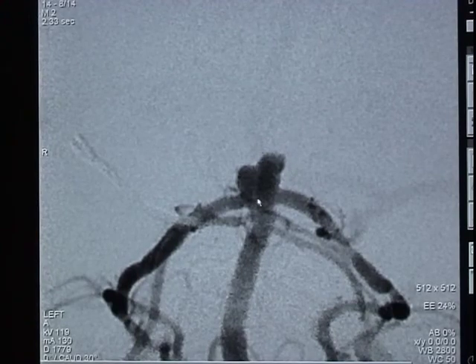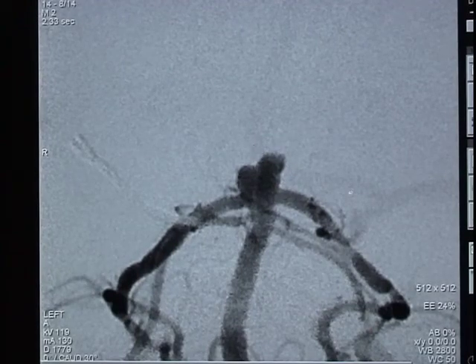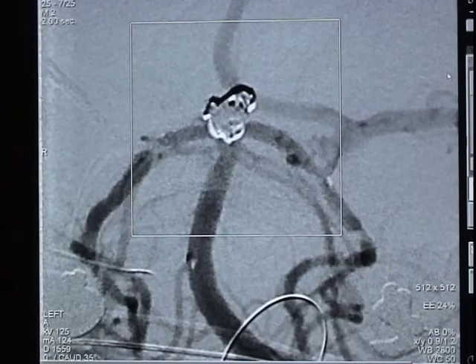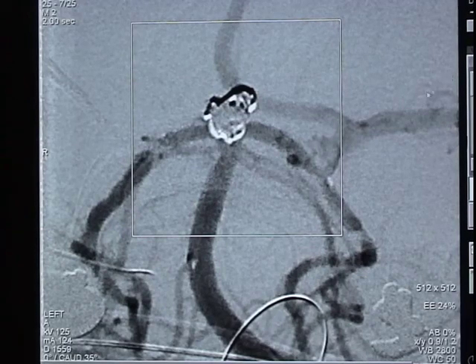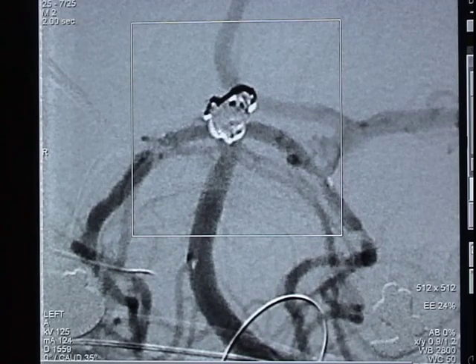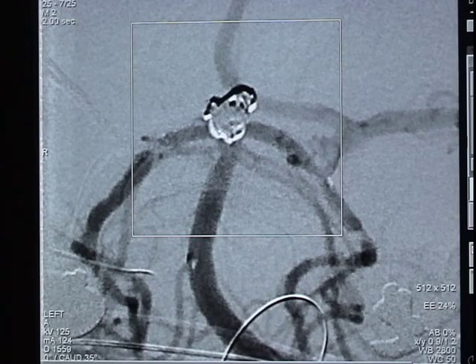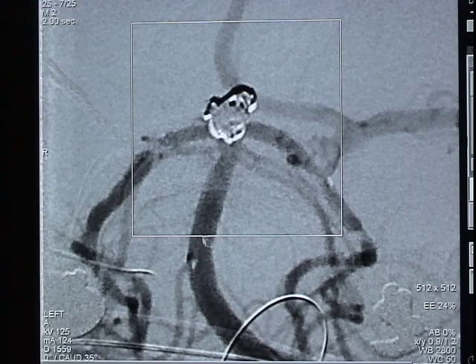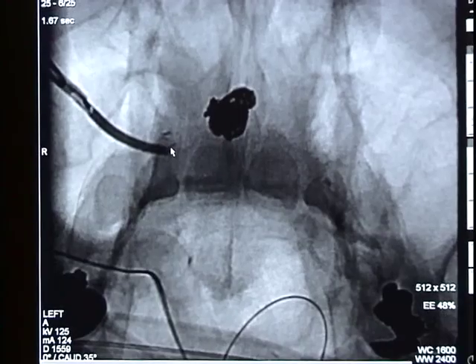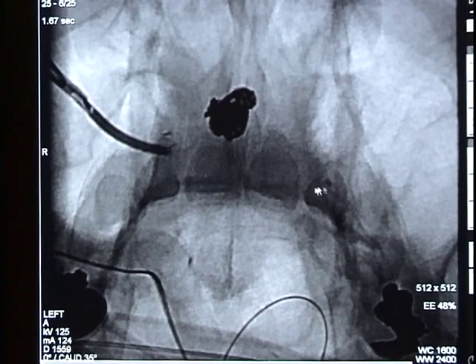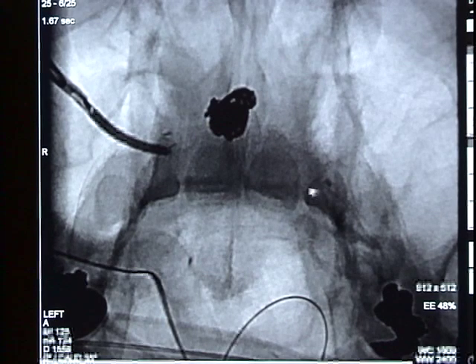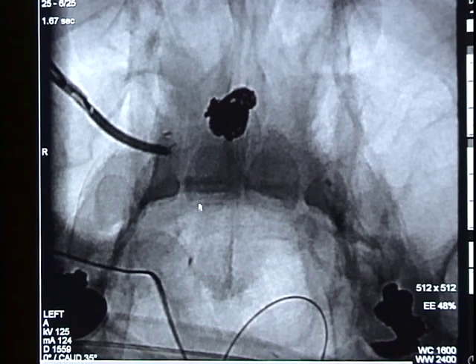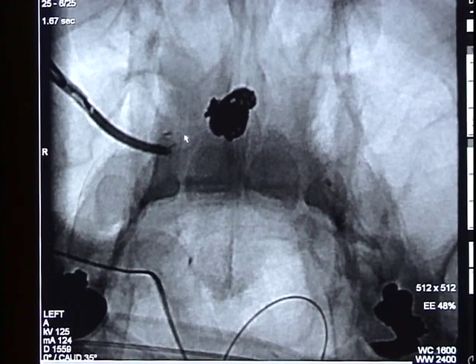Here is the aneurysm prior to treatment with its wide neck overlapping the basilar artery branch point. Here is the wide neck of the aneurysm. Here it is after treatment with a different view. While it looks as if coil is in the vessel, in fact it is in the fundus of the aneurysm that overlies the bifurcation of the vessel on this angiographic view. The neck remodeling devices keep all vessels open. Here we see the edges of the stents or neck remodeling devices, and we are tracing the course of the neck remodeling devices in the vessels.